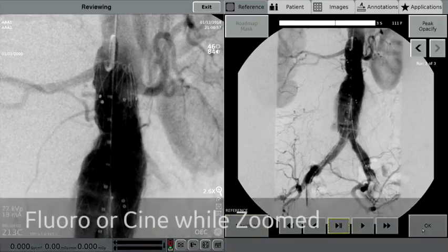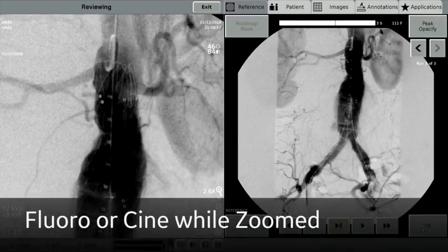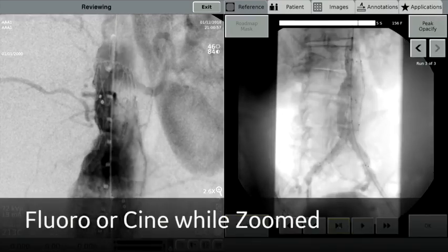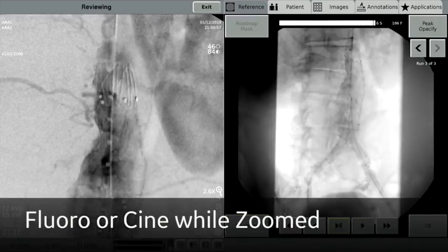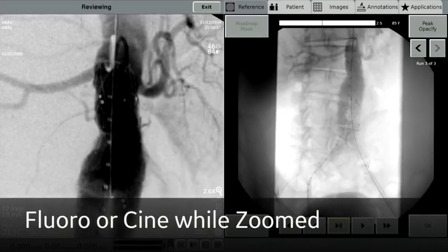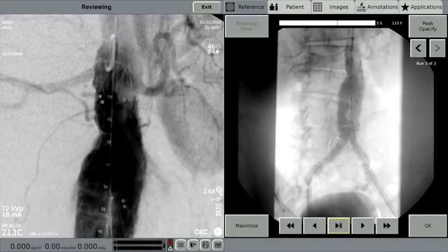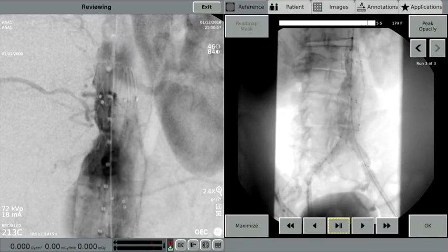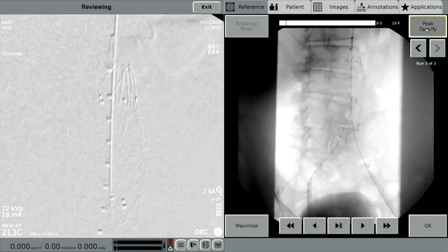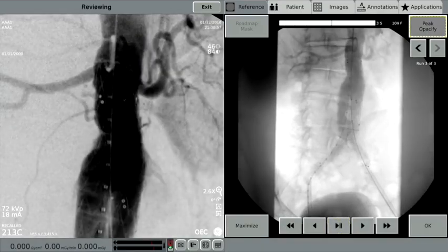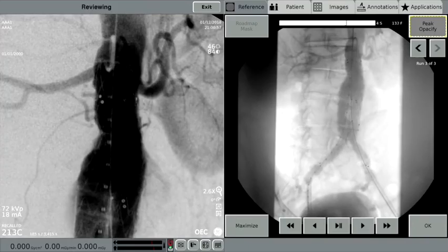Furthermore, additional fluoro or cine runs can be taken in Live Zoom and displayed with no change in technique or dose. Live Zoom delivers freedom in imaging as compared to mag modes, which have only two settings and require more technique, dose, and demand on the X-ray tube.